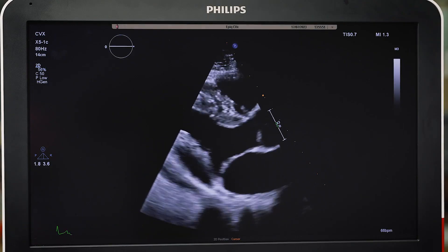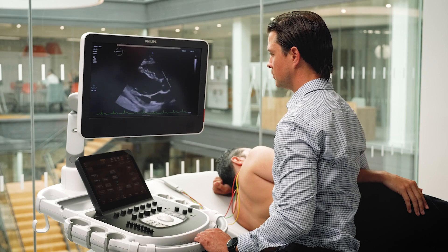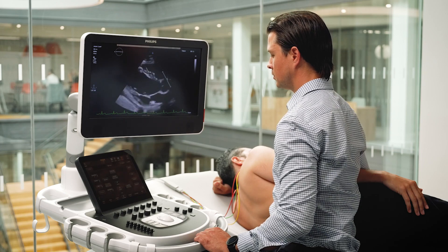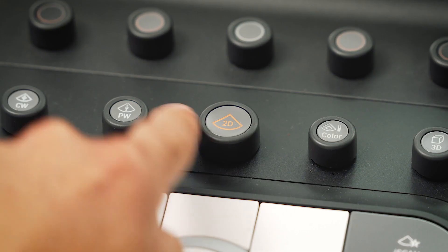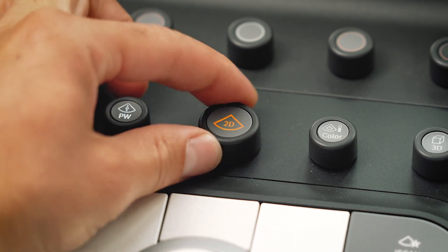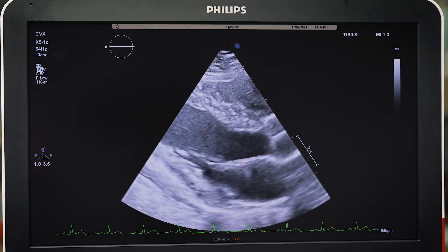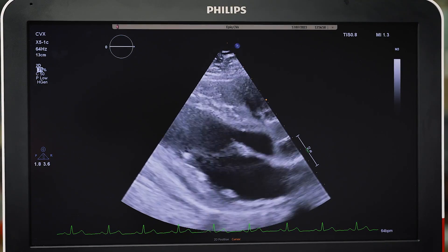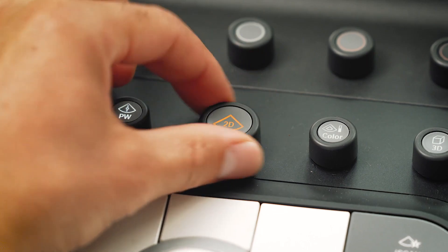Now, let's start with the fundamentals. Gain can be found on the 2D rotary dial. It can be increased or decreased to optimize the blood pool and endocardial border definition.